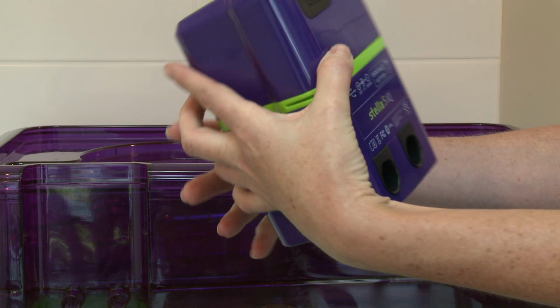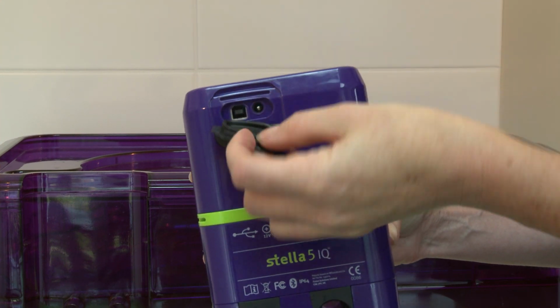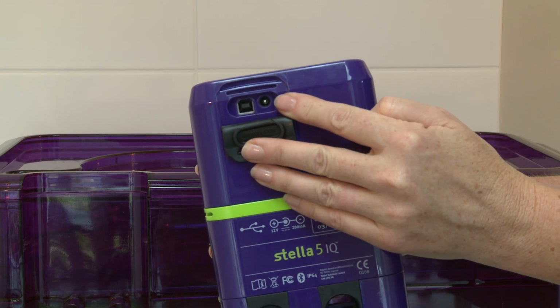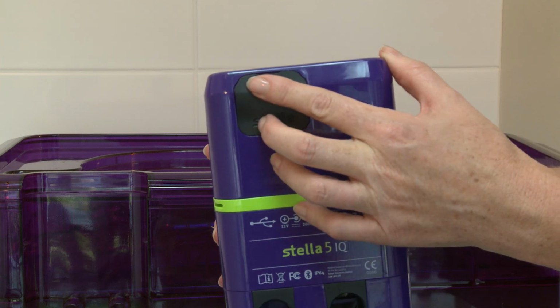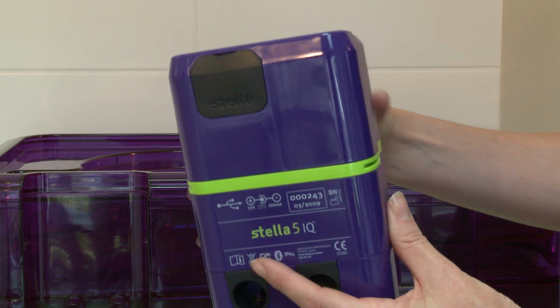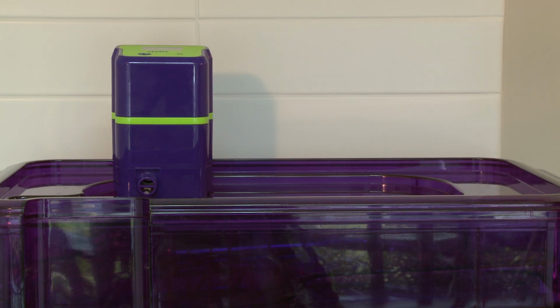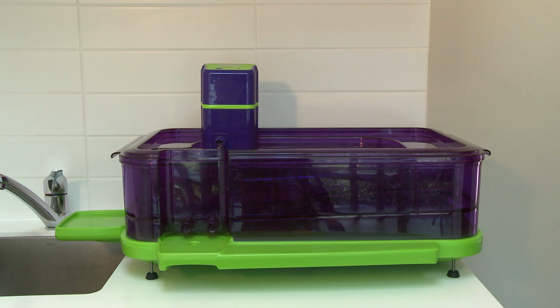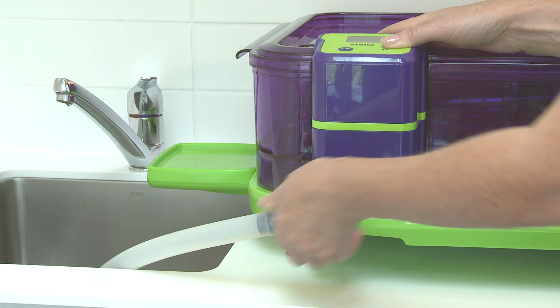Stella IQ is operated by battery power and charged when not in use by mains. When charging Stella IQ, peel back the black power port cover to connect the power adapter. Stella IQ should not be charged whilst attached to the base or near any forms of liquid. Once Stella IQ is fully charged, replace the power port cover firmly to ensure that no liquid can come in contact with the charging area. Stella IQ should be placed on a full 12-hour charge prior to first use. The LCD screen will confirm when the battery is full. A drainage hose is attached to Stella to drain disinfectant to waste.